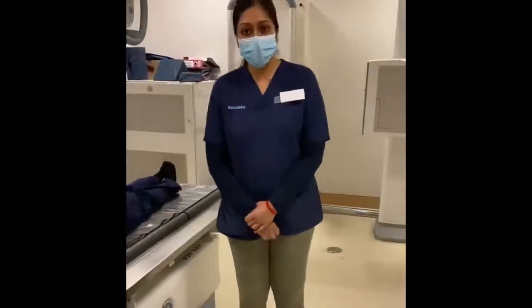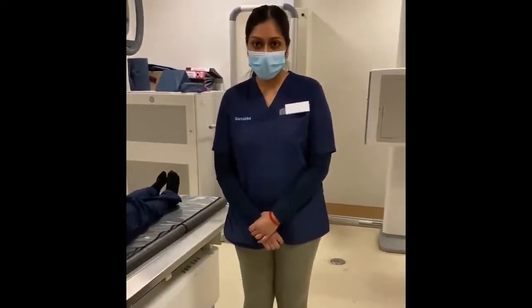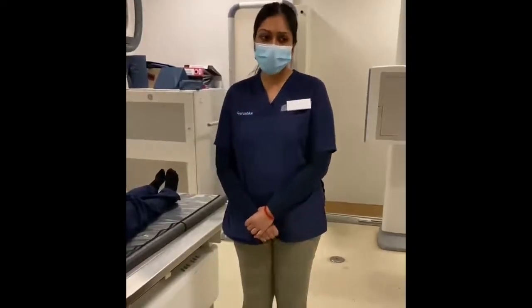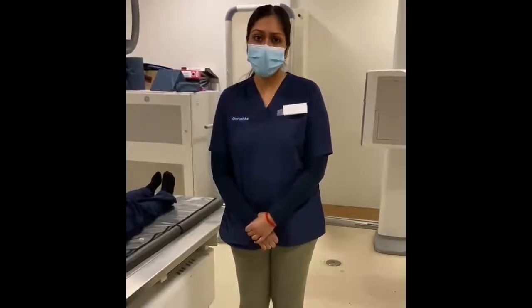So let's get started. Some of the most common indications for doing your thoracic spine x-rays would be trauma, like MVAs and falls, and degenerative changes like osteoporosis and osteopenia. You're also going to get infection and inflammatory diseases like cancers, TB, and multiple myeloma.